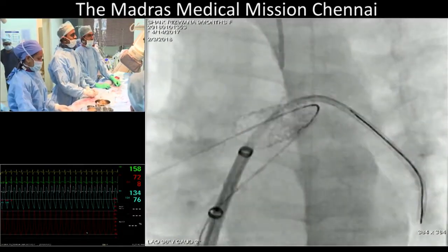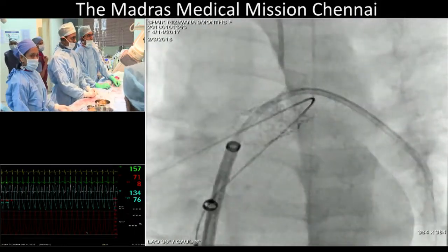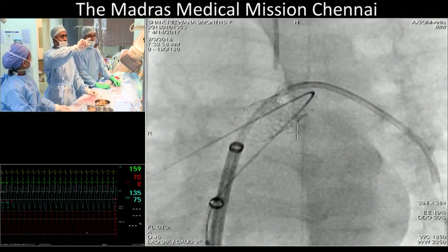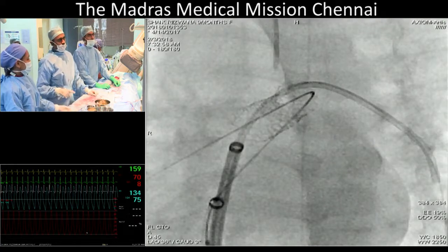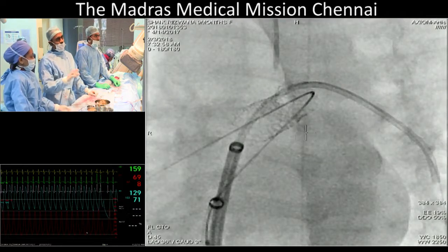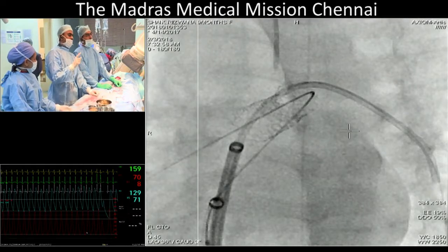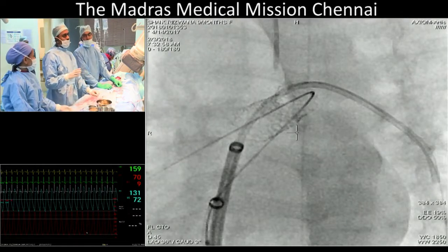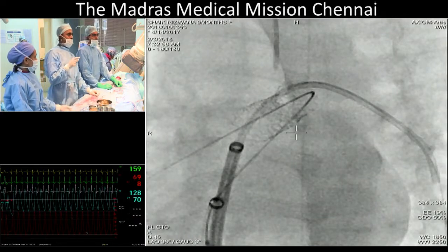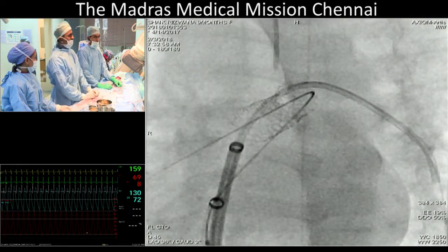Is Oliver there in the hall? Shaq, is Oliver there in the hall? No, Oliver is in with Tin doing the case. Okay. So we're going to go to Tin now, then come back to you. I wanted to make one point on Kevin's point. What Oliver says is the stent is the same in a 418 8 millimeter and a 535 8 millimeter. It is the balloon that varies. And he says that an 8 millimeter Formula 418 on in vitro testing, he has blown it up to 16 with no foreshortening. Actually he has written a paper on that. So that was the reason why I wanted to know whether Oliver is there.